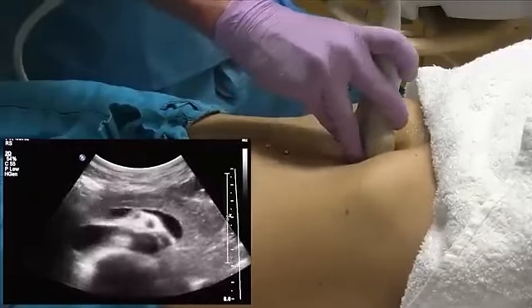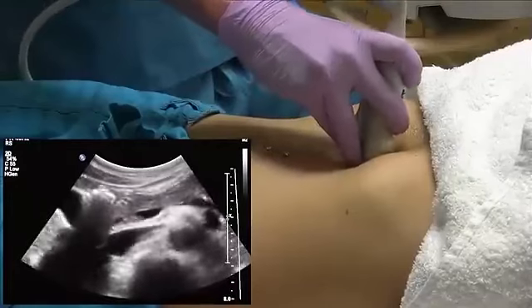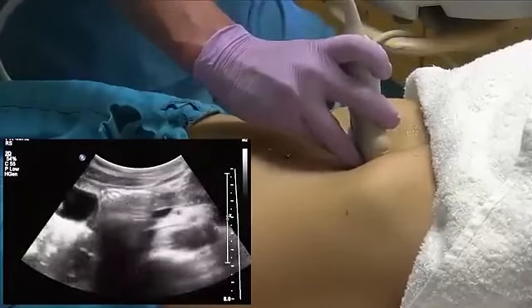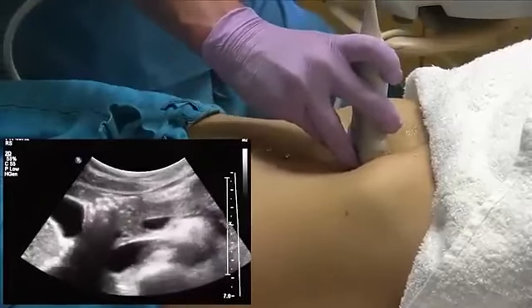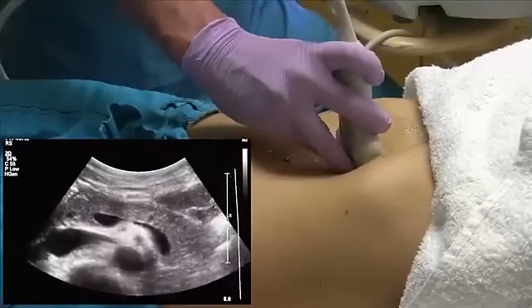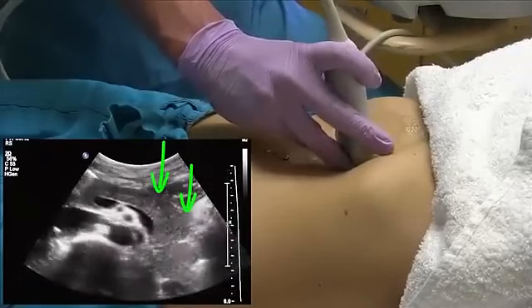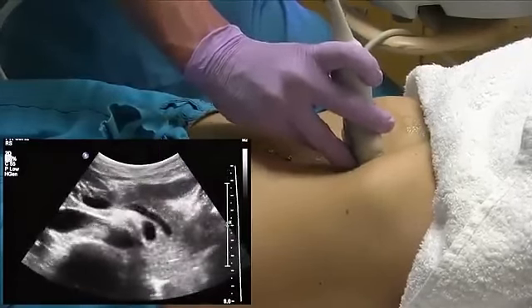We'll also try to look at the head and uncinate process all the way down to the tail of the pancreas. In most patients, you probably won't be able to see the entire tail of the pancreas just because it kind of dives deep from this position here.